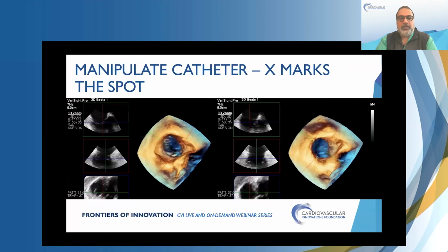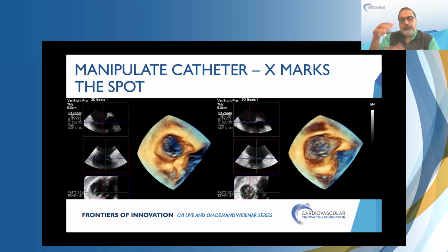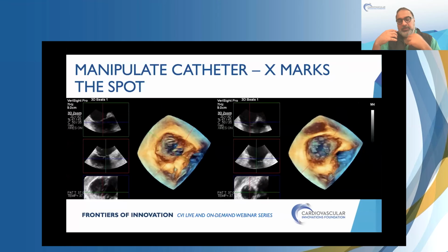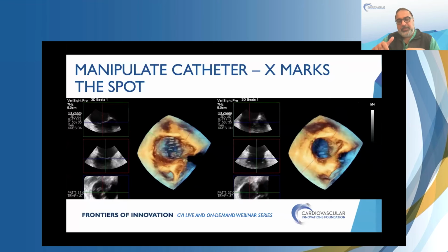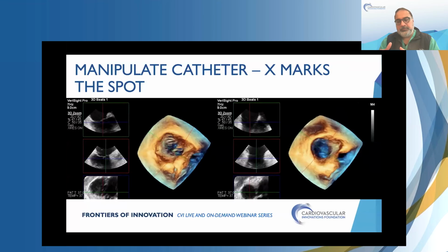And Edris, if I can comment, this is exactly where you and I would talk, and as Lynne showed, for the interventionalists that are watching, you manipulate the ICE catheter exactly the same way that you would manipulate the TriLuminate or the TriClip system.